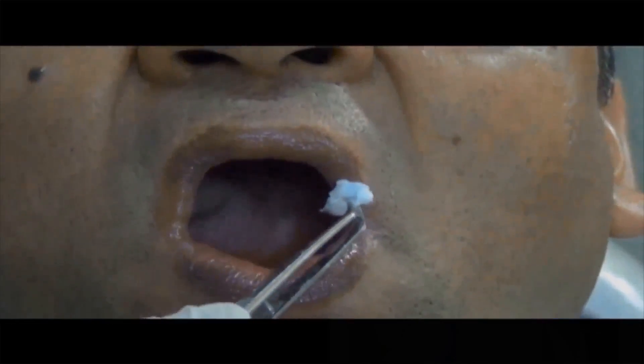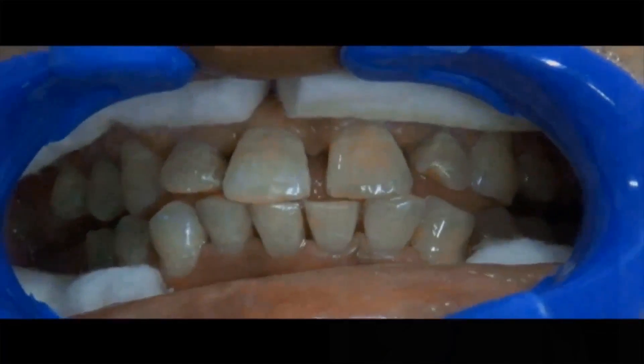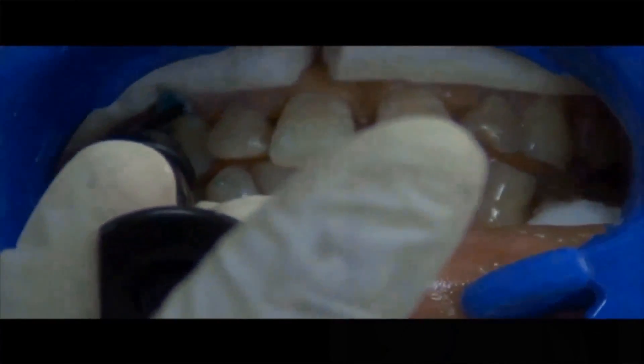Apply Vaseline to the teeth, insert the cheek retractor and the cotton rolls for increased patient protection. Express a continuous bead of liquid dam along the gingival margin, overlapping 0.5 mm onto the enamel.